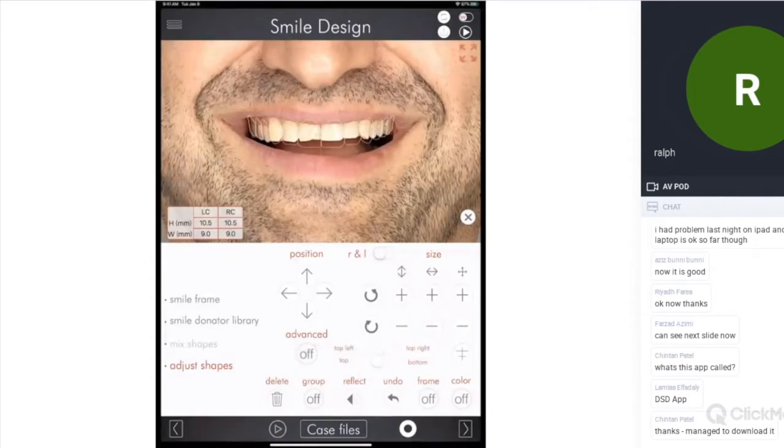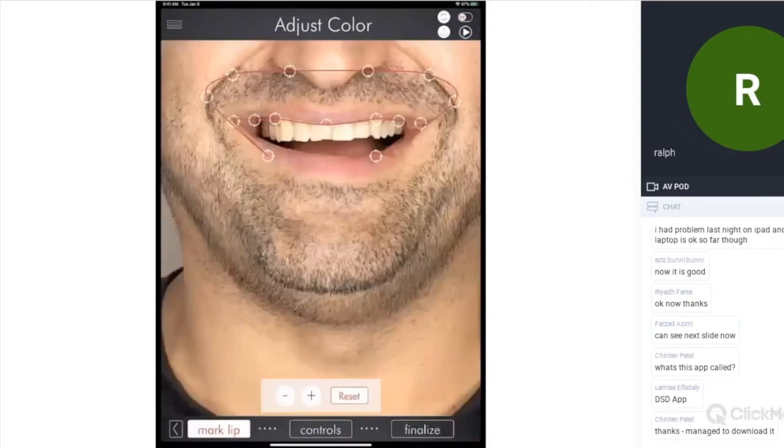When we analyze my occlusal view with the intraoral scan, we are going to see that the arch needs to be modified with ortho and needs to be brought buccal. So in this case, we see the proportions are on one side correct, on the other side not correct. That means we need to analyze the arch and the buccal corridor. Okay, so I think it's fine. I go to the next screen.